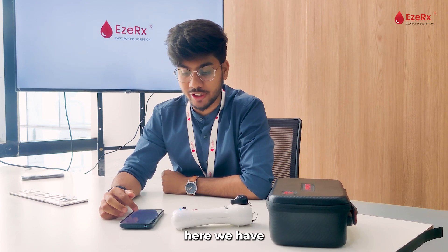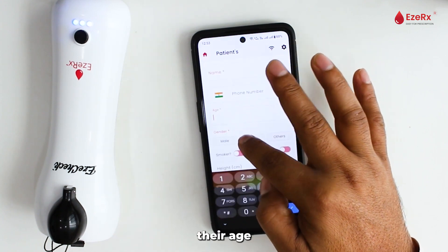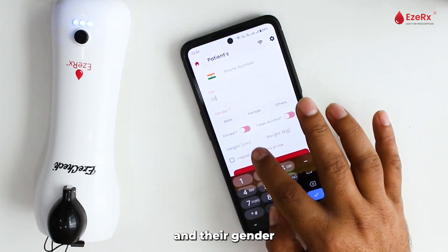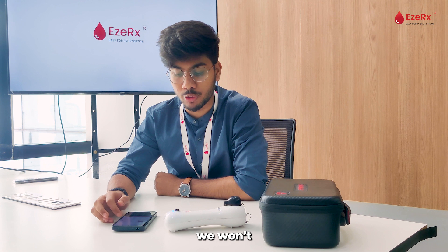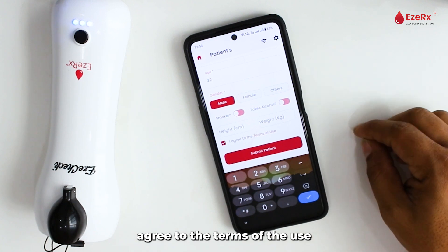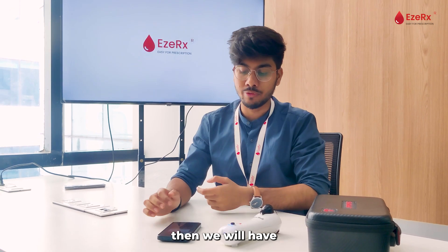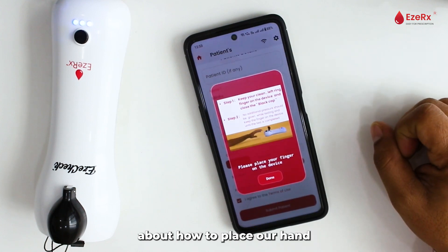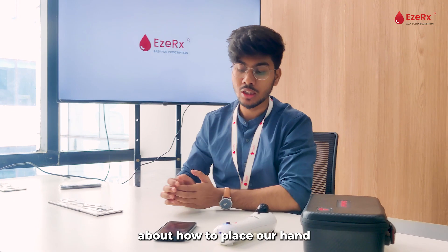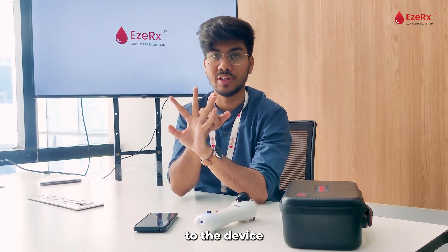Here we have patient details to fill in, while three fields are extremely necessary: their name, their age, and their gender. Without filling in this form, we won't be able to proceed. After filling in the form, we will have to agree with the terms of use and submit the patient details. We will then receive the instruction on how to place our hand — we will have to place the left hand ring finger in the device.